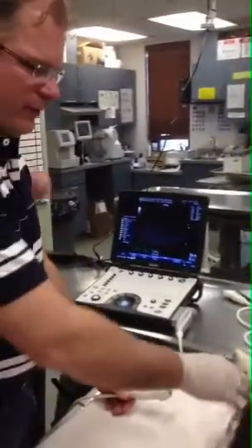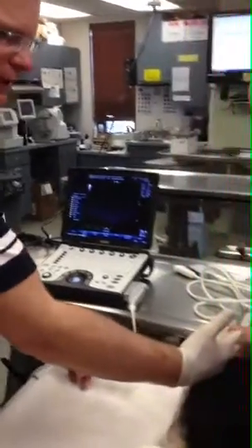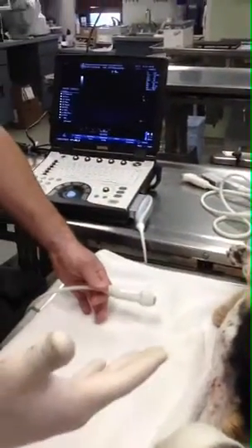Normally we'd flip the dog over and do a left-sided view, but you don't have to. What you can do is use your fingers to just collapse the lung. And if you have pericardial effusion, you're going to have a monster window anyway.